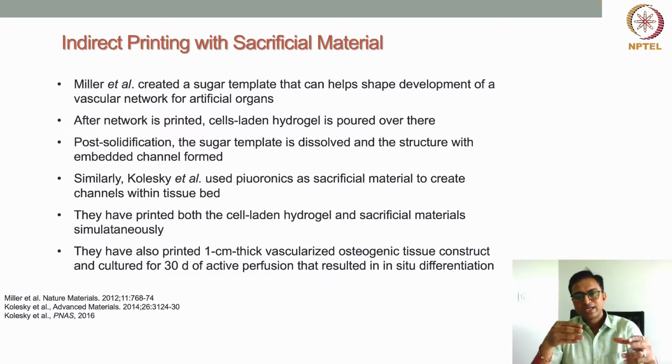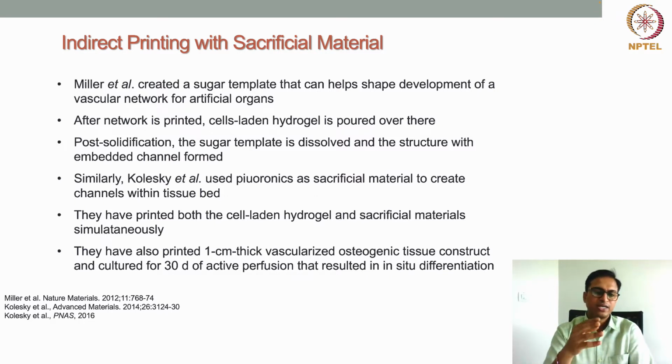In this way, these channels can again be perfused with media, and they can also be perfused with endothelial cells. The endothelial cells bind to the inner lining of the channels, and by this way a vascularized tissue construct, where the vascular tissue is embedded within the tissue block, can be developed.